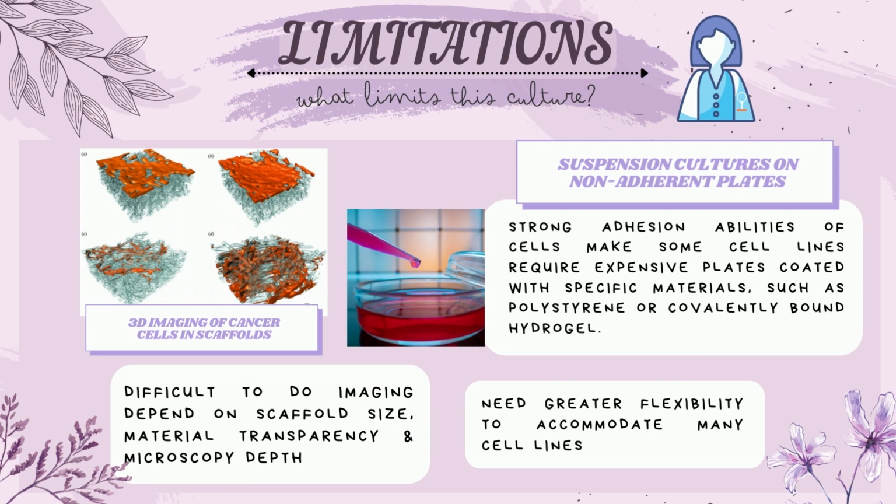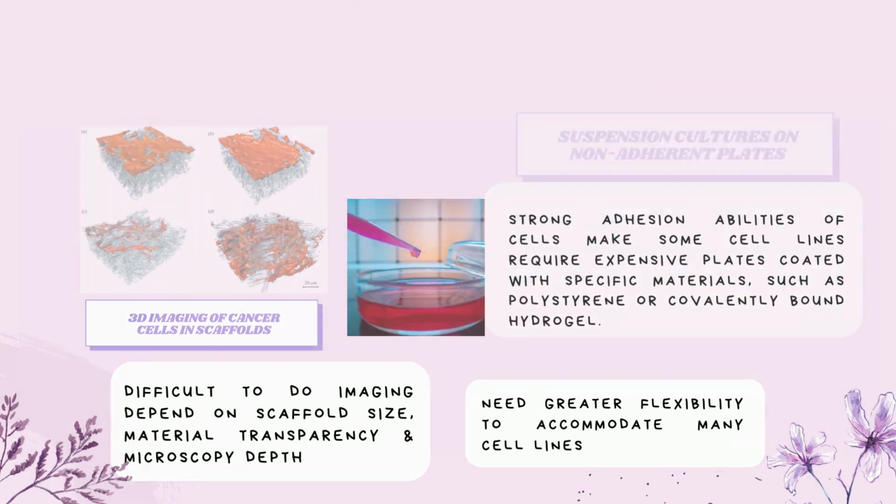Under suspension cultures on non-adherent plates, the strong adhesion abilities of cells make some cell lines require expensive plates coated with specific materials such as polystyrene or covalently bound hydrogel.